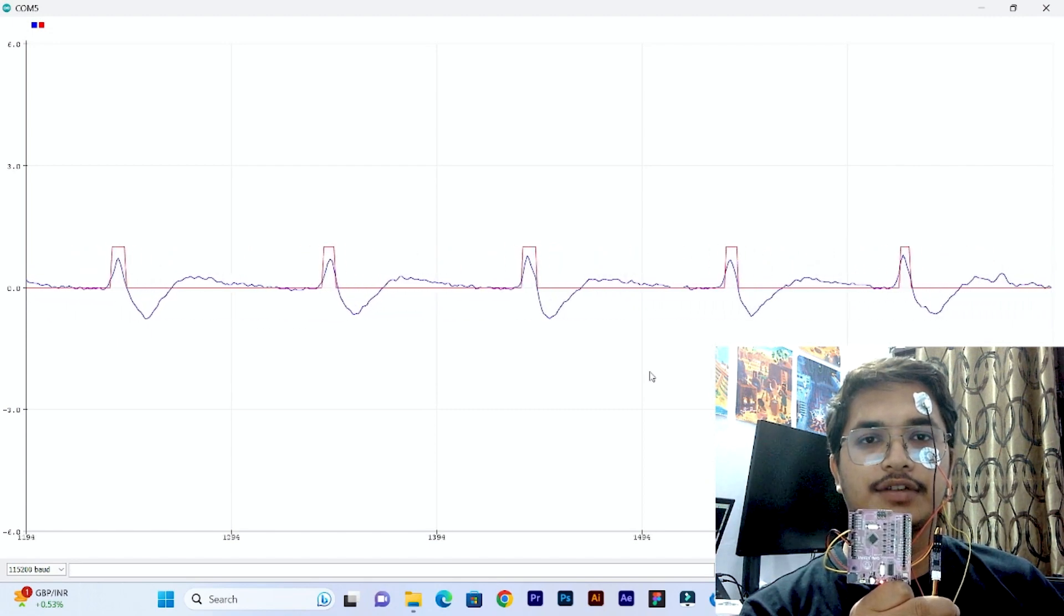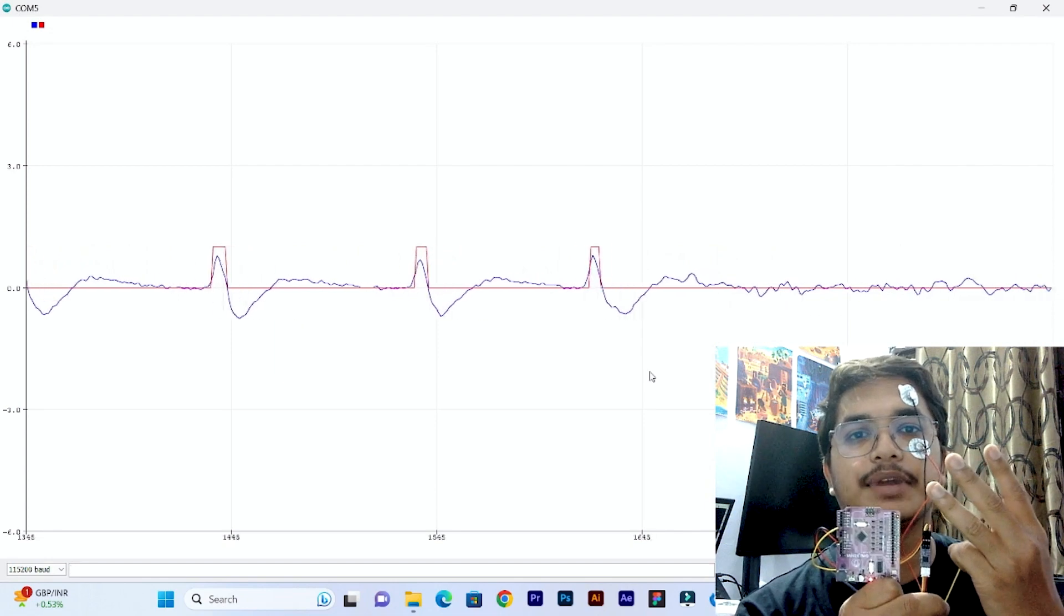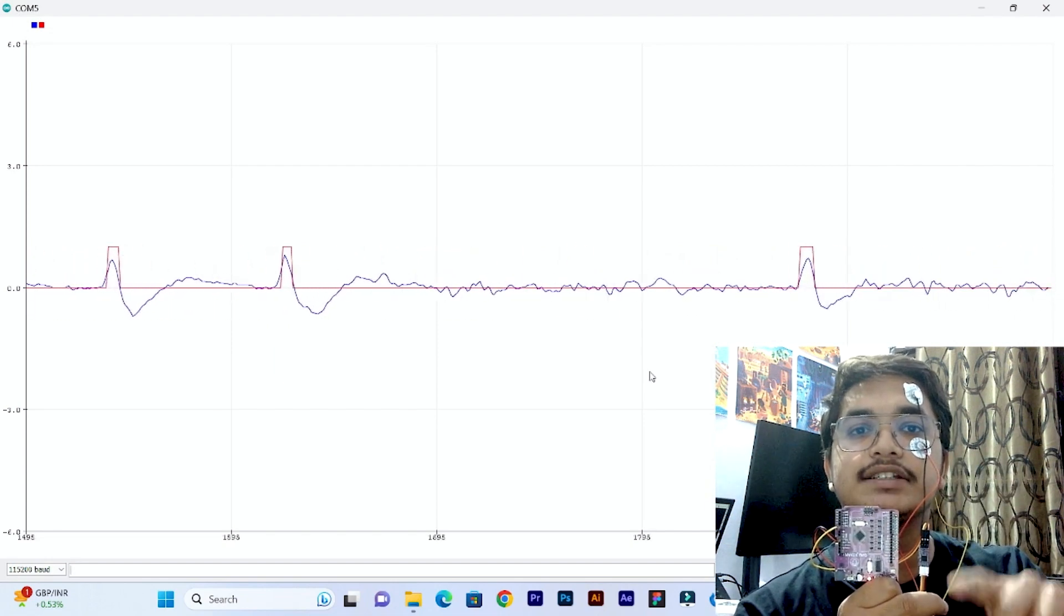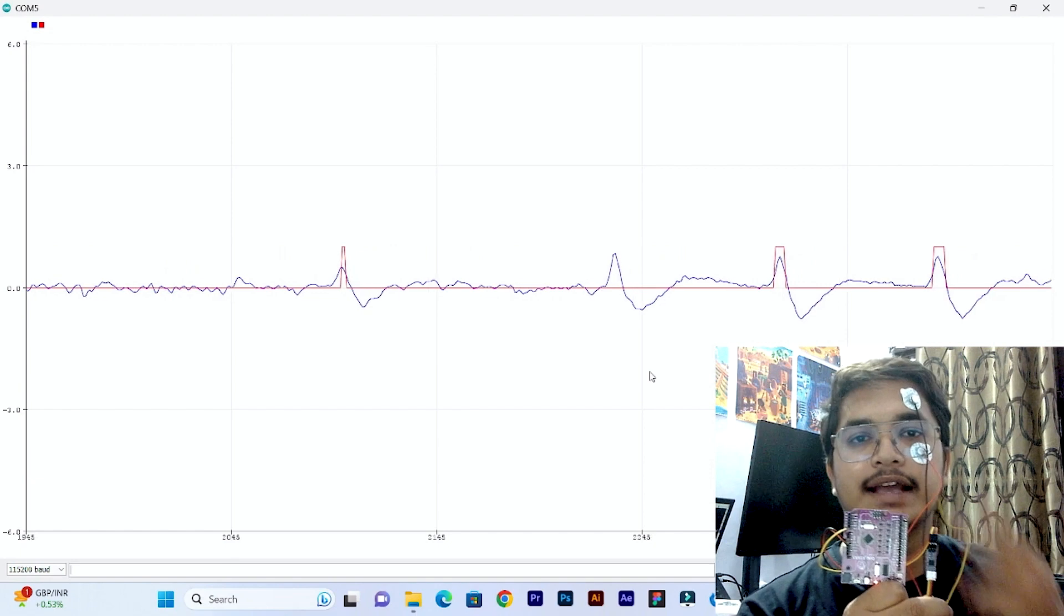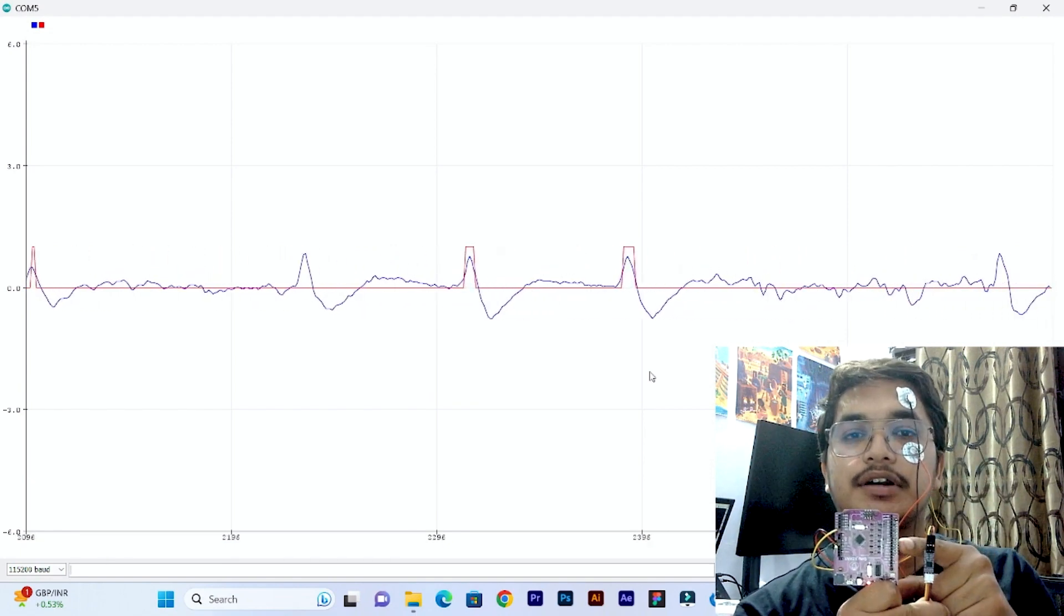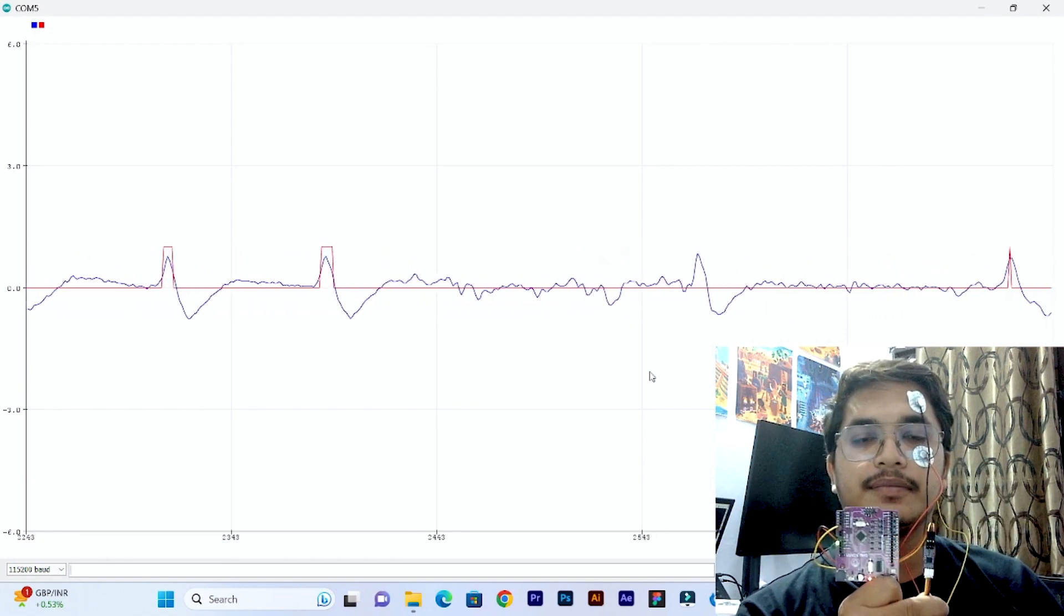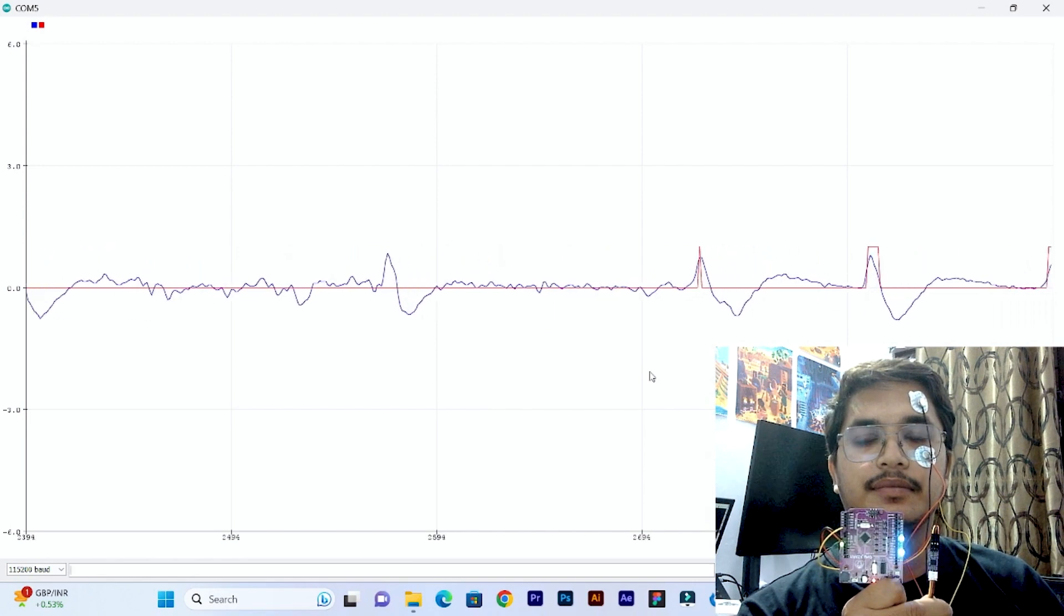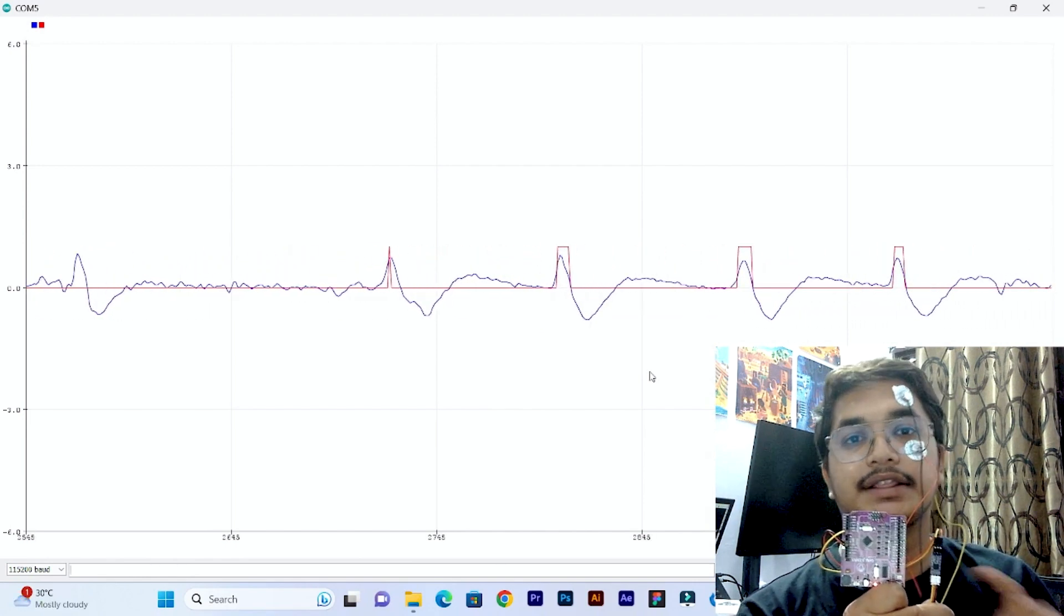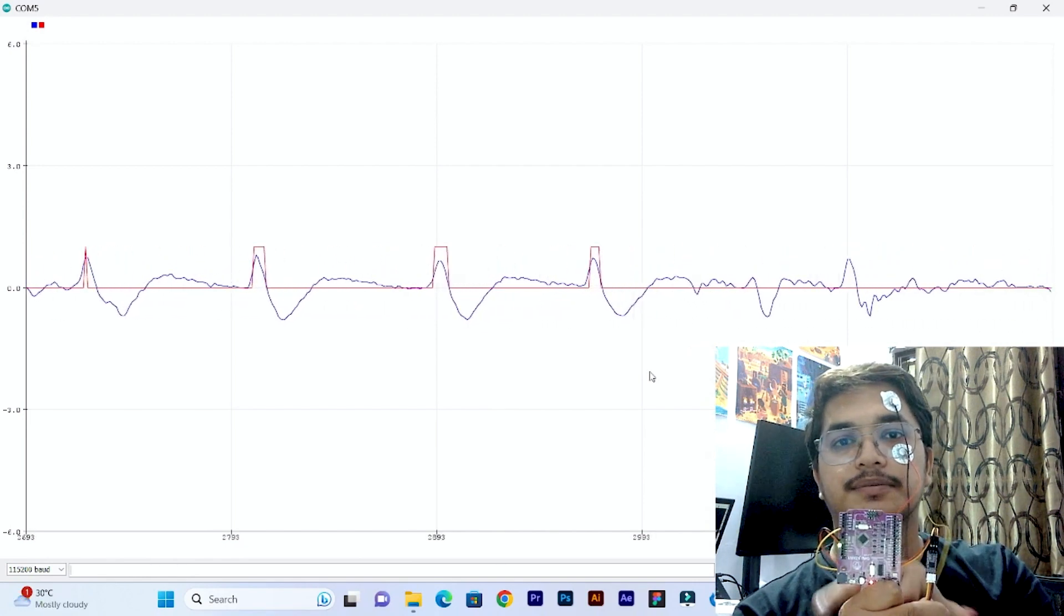So when I am blinking three things are happening. First, you can visualize the blinks on the screen on serial plotter. Second, the LED on pin 13 is glowing. And third, the buzzer is getting on.